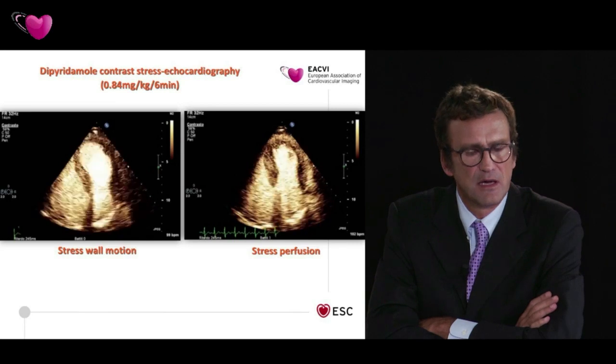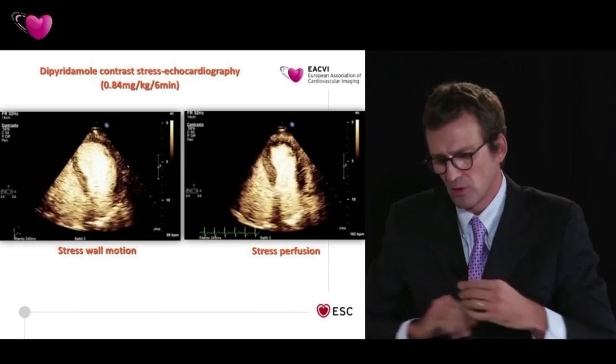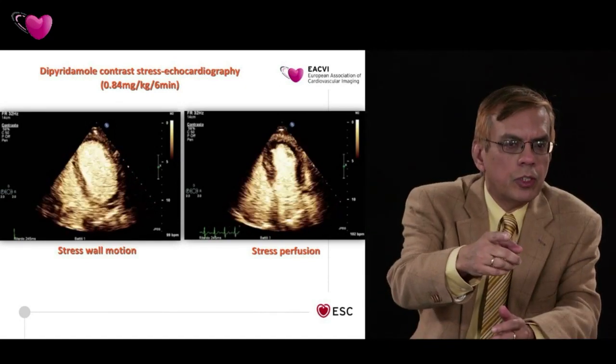If it's fully replenished after 2 seconds, it's normal, so there is no coronary stenosis. If it's not, it is not normal. So how do you assess seconds? You're looking at beats, but how can you talk about seconds here?